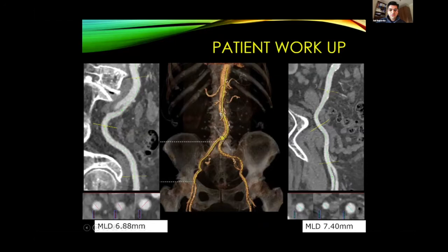The first is before we've even started the procedure, with regards to patient workup, and we increasingly are using much more modern and high resolution imaging techniques, for example here with CT, assessing suitability for transfemoral access. You can see in this patient we have minimally tortuous, non-calcified large vessels that would be suitable for transfemoral TAVI access.